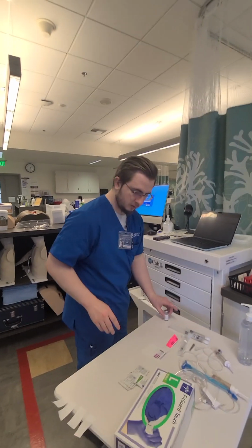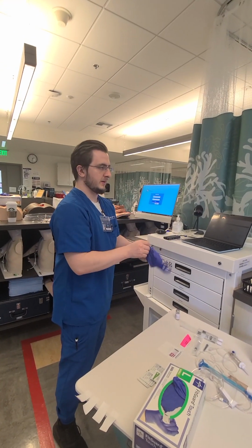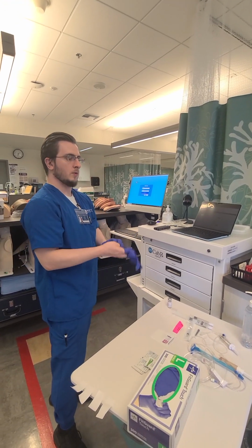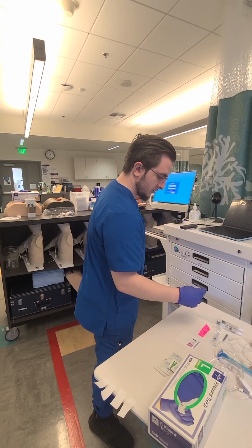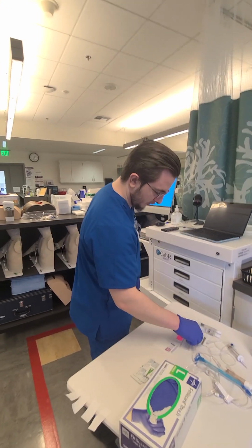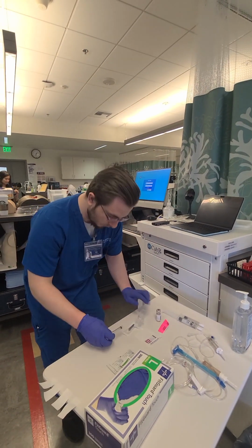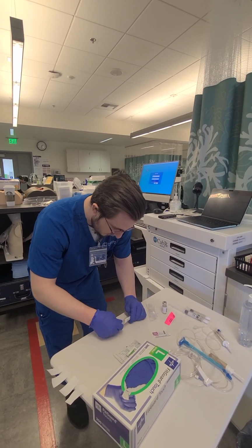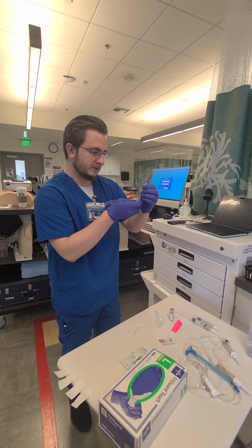I'm going to draw up my Zofran. Zofran is IV push, so I'd have to look this up either now or before to make sure I know how quickly to push. And Zofran is pushed over 2 to 3 minutes. So when I'm giving it, I'll push it over 2 minutes. I'm going to get out my 3 milliliter syringe and a blunt needle to draw it up. I need 2 milliliters for 4 milligrams of medication.